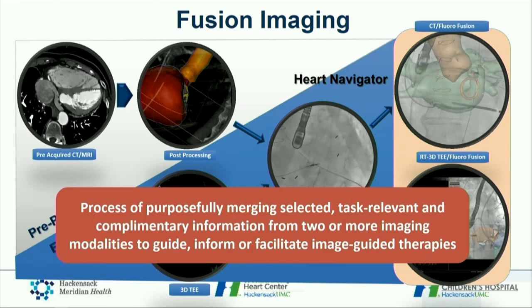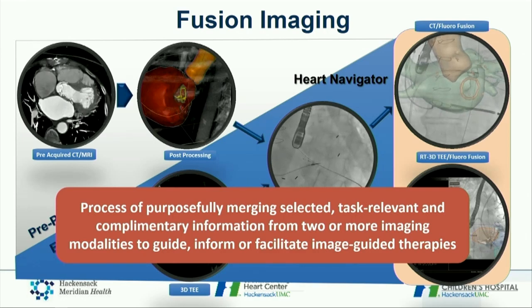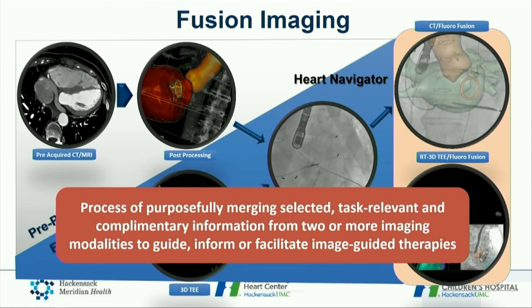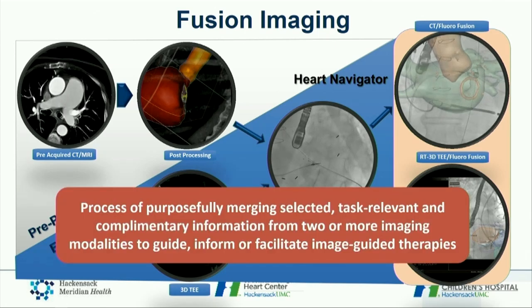To define fusion imaging, it's a process of purposefully merging selected, task-relevant, and complementary information from two or more imaging modalities to guide, inform, or facilitate imaging-guided therapies. It's a mouthful, but it encompasses most of the things we do with fusion imaging.